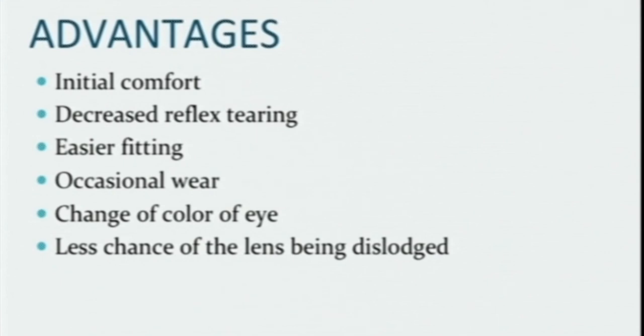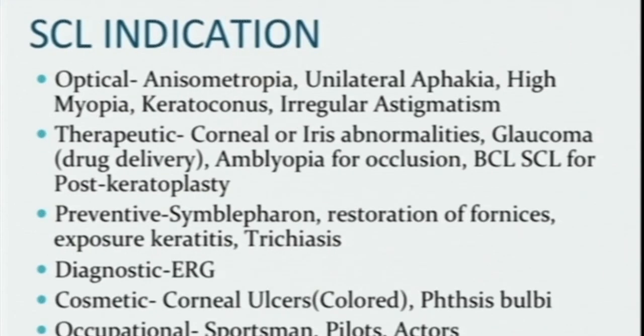The advantage in the contact lens is the initial comfort, but for some it might be a little bit of discomfort, watering will be there, you'll have to reassure the patient. And fitting will be easier if you sit along with the patient other than the optometrist, if you have time. And you'll have to talk about the advantages of occasional wear and change of color of the eye and less chances of lens being dislodged, which the patient might be having. The soft contact lens indications are optical, therapeutic, preventive, diagnostic, and cosmetic, and some occupational also.